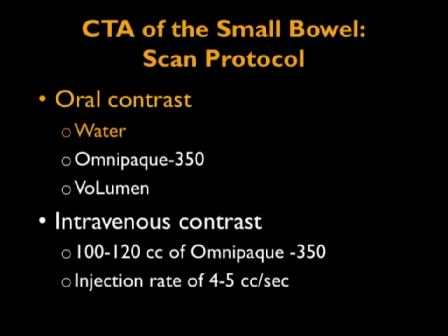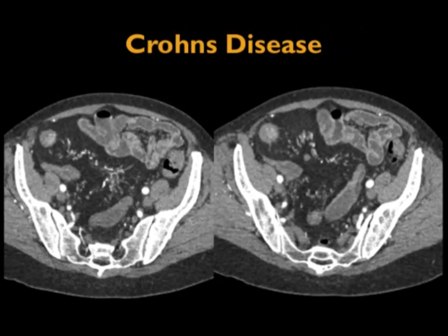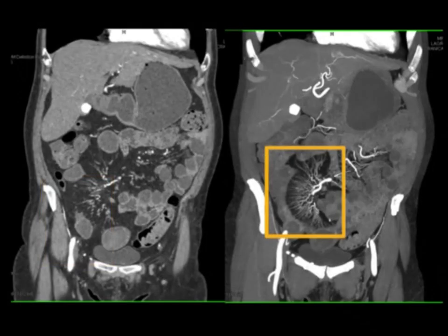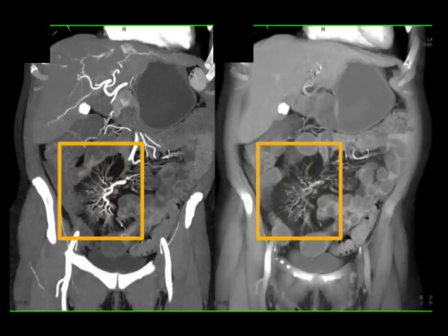With water, you can see the bowel wall better, the vessels going to the bowel wall, and the perfusion and enhancement of bowel. So in this case of Crohn's disease, on the axials you'll see fibro-fatty proliferation of the mesentery and prominent vessels. On the coronal view, you see the full length of involvement, the stricture, the abnormal enhancement, and the increased vasa recta — even better with MIP imaging. The prominent vasa recta is classic for active inflammatory bowel disease, typically active Crohn's disease.